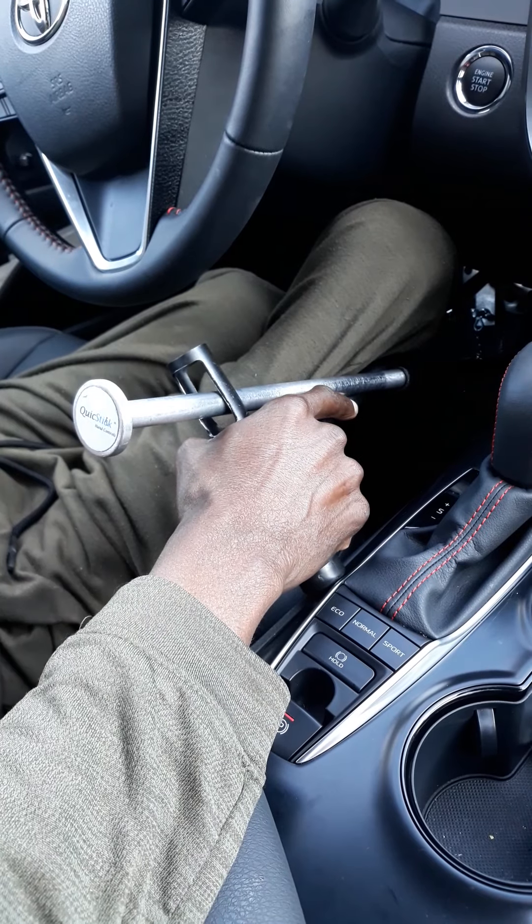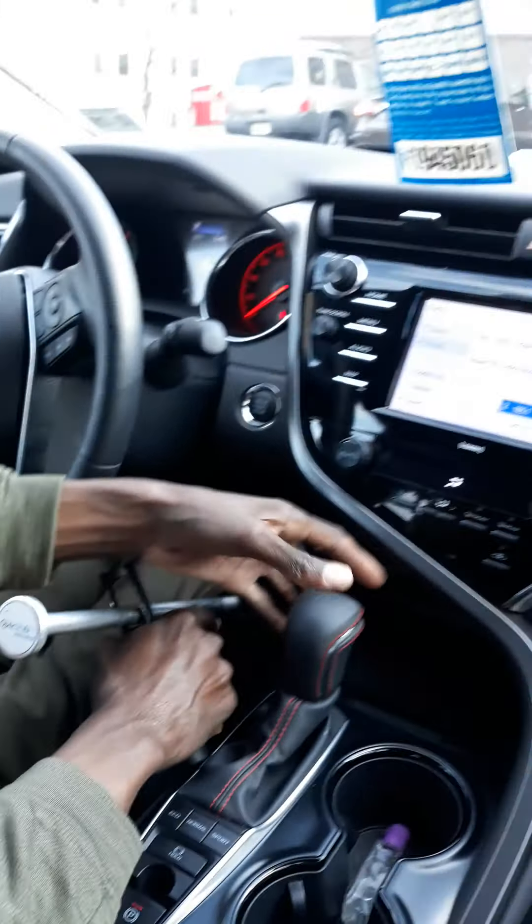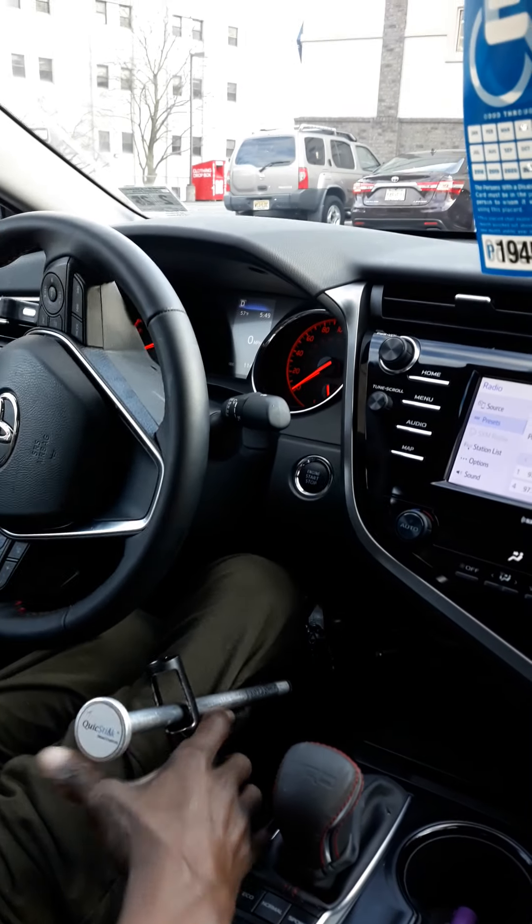Because at the end of the day, you still got to transport the vehicle as well as push yourself to wherever you're going when you get to your destination. So I push in on the brake, I hold the brake down, I grab my lever switch, I shift to drive. That's it — then you're off.